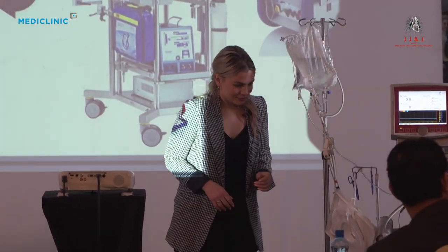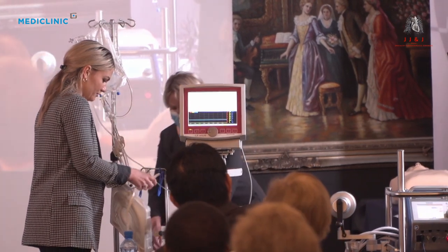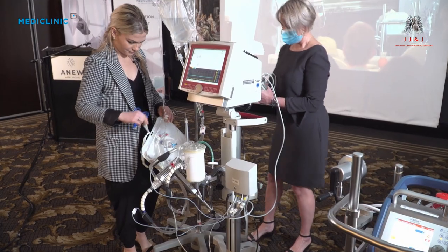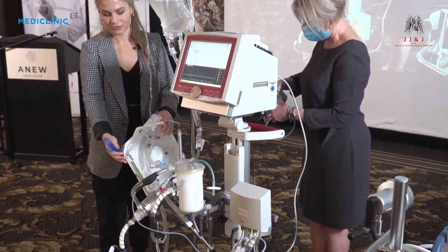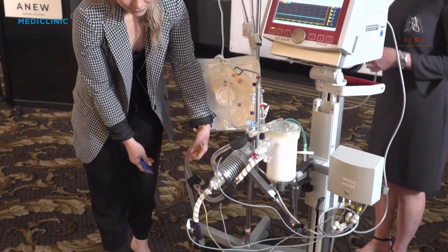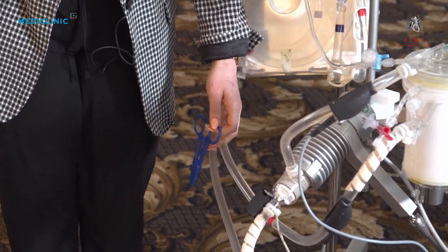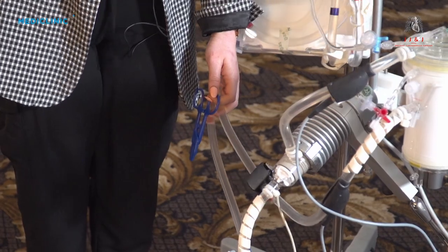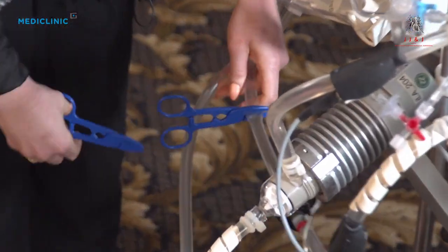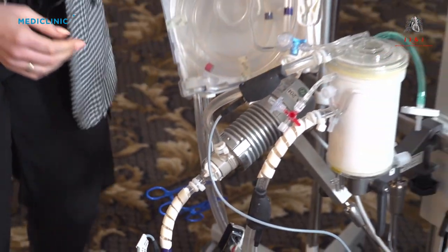On the Nova Lung system: imagine this is our patient, with the arterial and venous lines. If your machine fails, the pump has already stopped, so you're not going to stop it yourself. You're going to clamp your two lines. Then you've got a separate battery system in your unit.